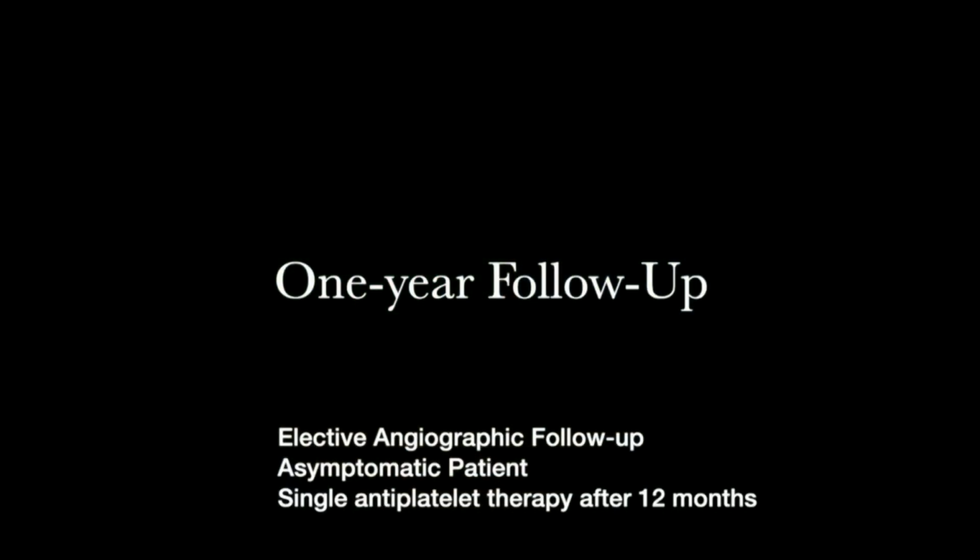That's the reason why, Emanuele, we decided to prepare this case today, because it's very important to give information on the... Well, 1 year is not long term, but you know that most of the events happening after a PCI, they occur within 12 months. So the patient interrupted dual antiplatelet therapy after 12 months. We called her, and she agreed to electively perform an invasive assessment of the result. Can we please see the film so we get into the details?